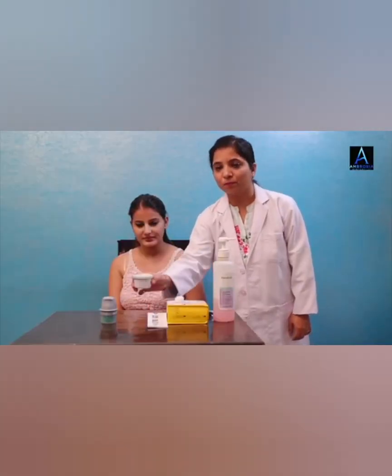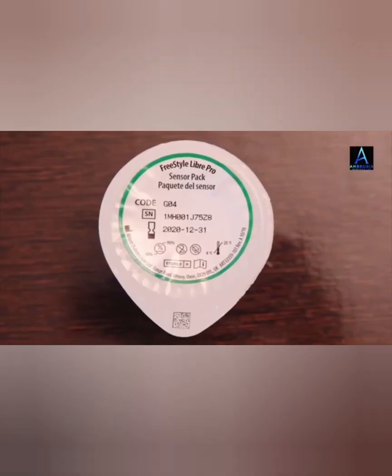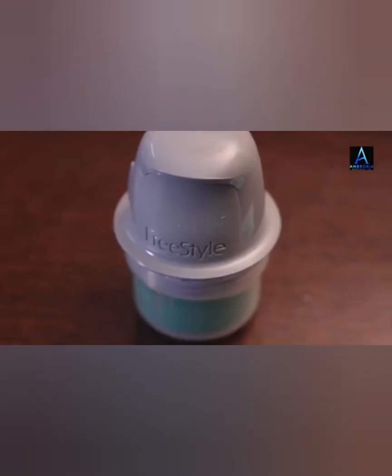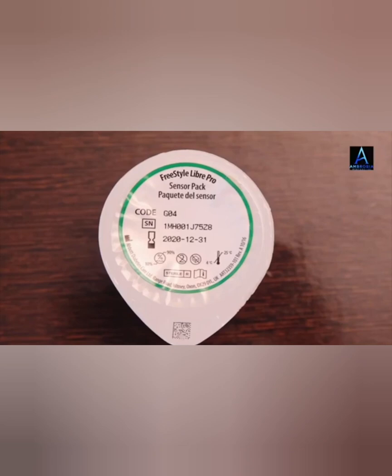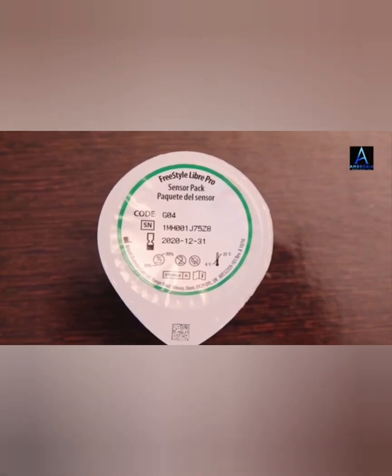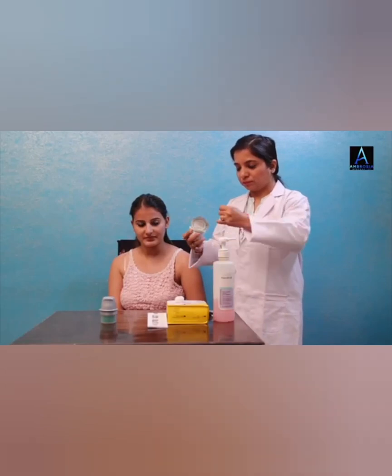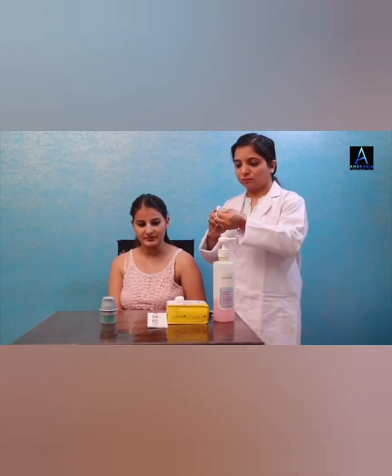Now, this is the sensor pack which includes a Libre Pro Sensor, a Sensor Applicator and an Alcohol Wipe. We are going to open the sensor pack by peeling the lid off completely.